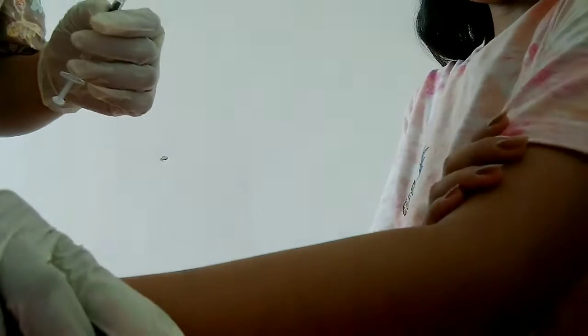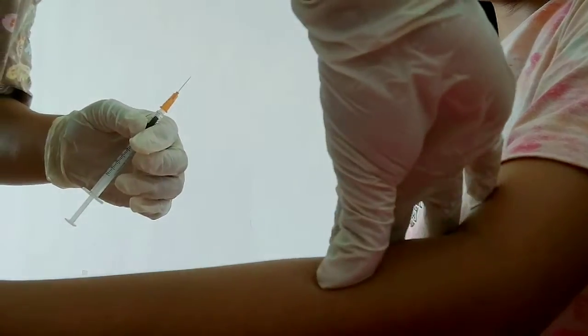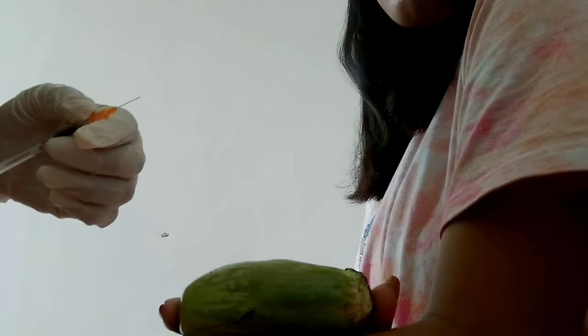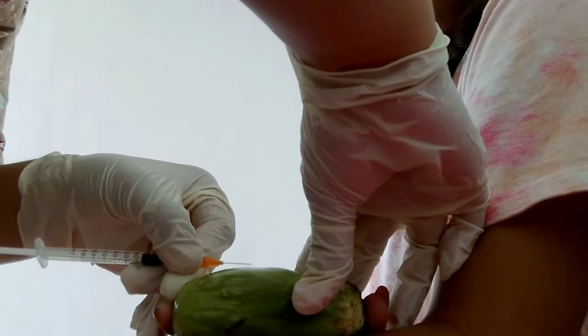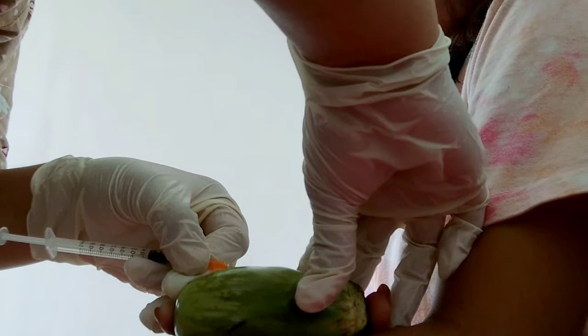Stretch the skin using the non-dominant hand by gently pulling the skin. Bring the needle close to the patient's skin and insert the needle at about a 5 to 15 degree angle.